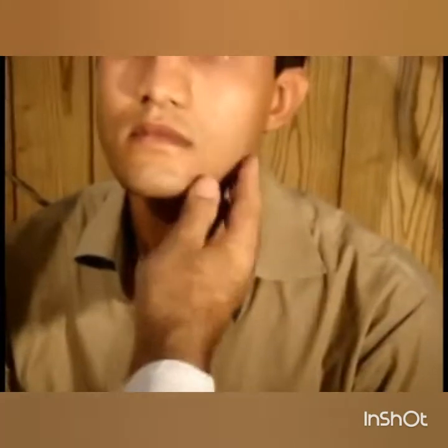Then we will go inside to see the larynx from inside, which is called indirect laryngoscopy. We will instruct the patient to open the mouth, bring the tongue out. We will take the tongue out and I will hold it with this. It will not be painful, we will examine your throat with the mirror. You will not have any pain, just stay completely relaxed.